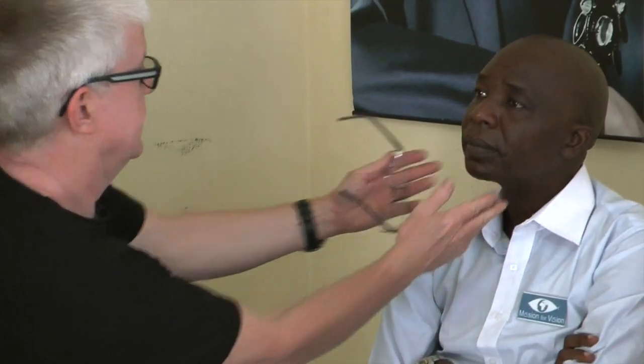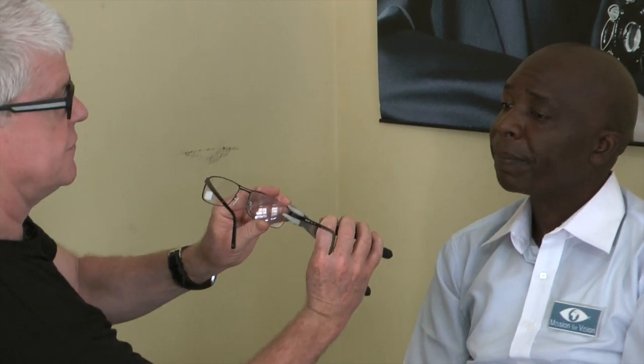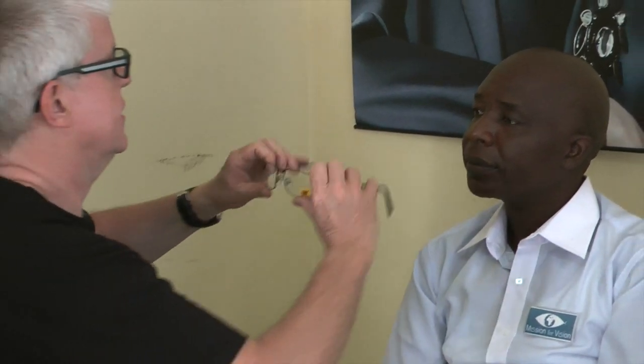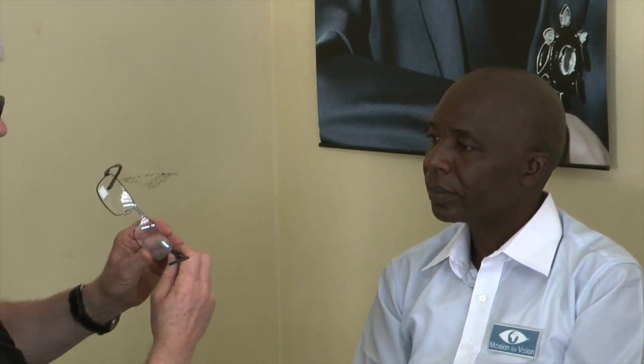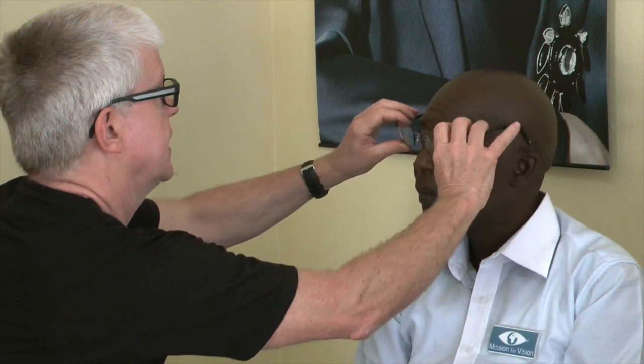Remy's got one ear that's a little lower than the other. So what I would do is I would adjust the frame up on that side and down on the other, and then we would get a slightly better fit. So we've got a frame now that's sitting nice and straight.